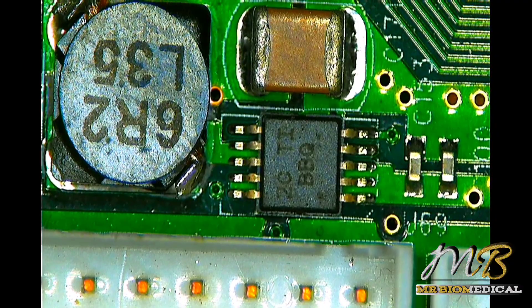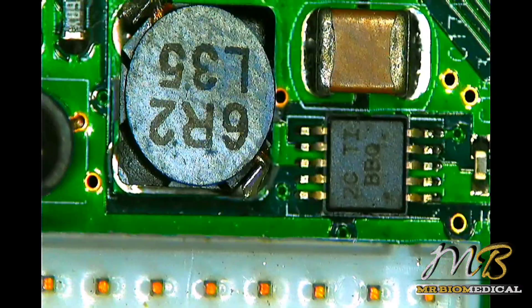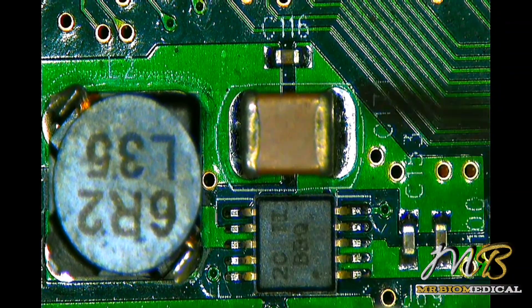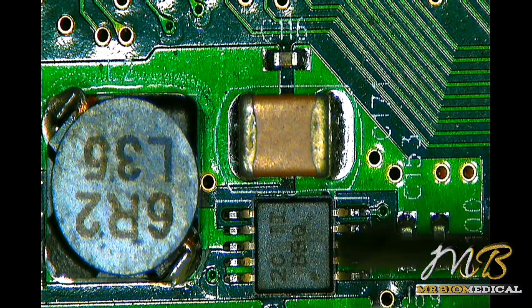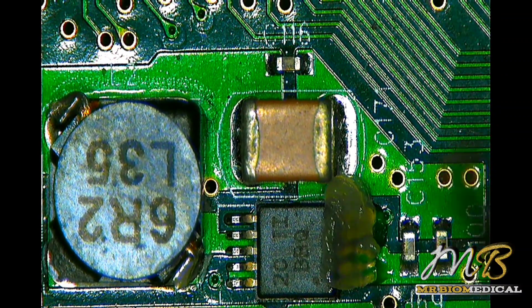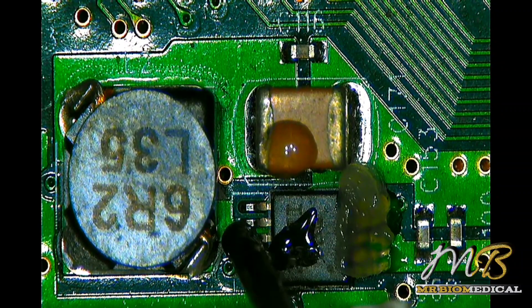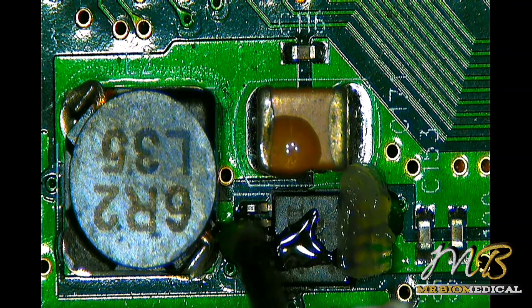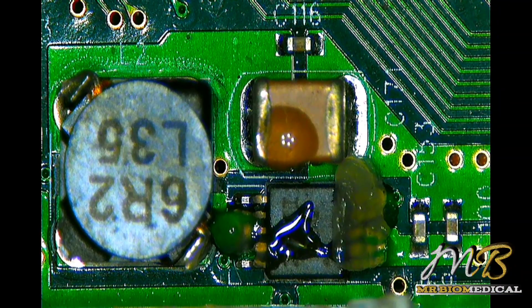The thermal camera has confirmed that this IC is faulty. Let's remove it and check whether the short is gone. Before removing the component, we should apply flux — that will help to remove the IC from the board easily.